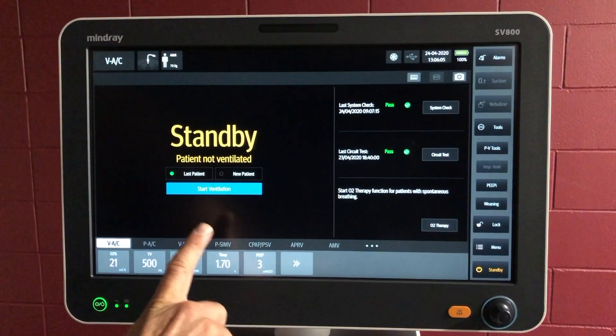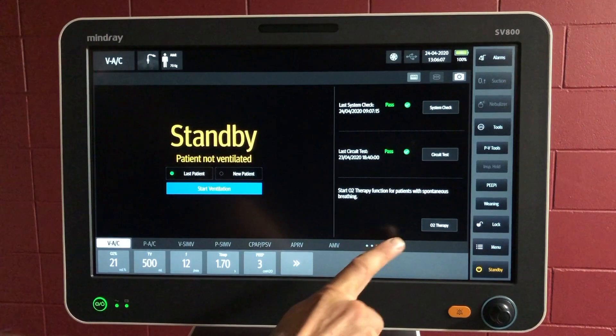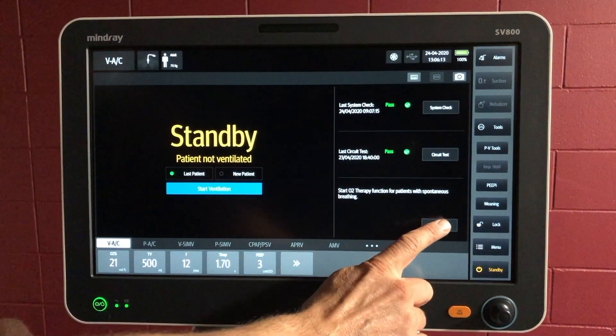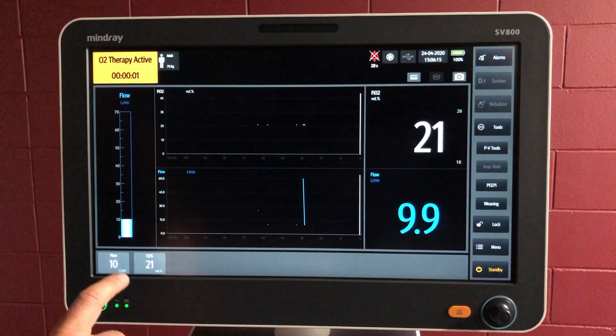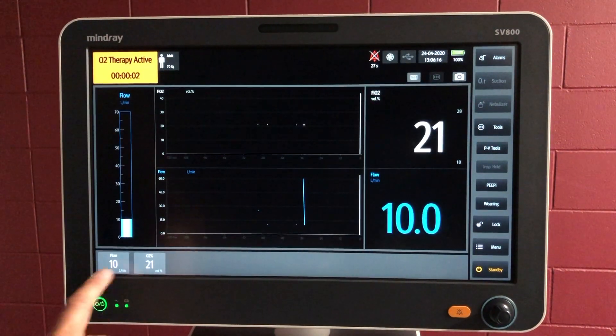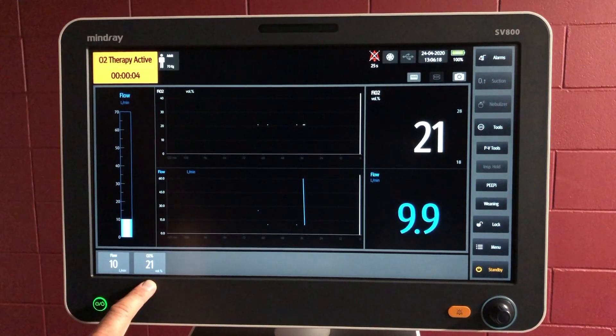So let's start from the standby screen — we can go straight into oxygen therapy. You push that button, O2 therapy, and it gives you two settings: the flow and FiO2.